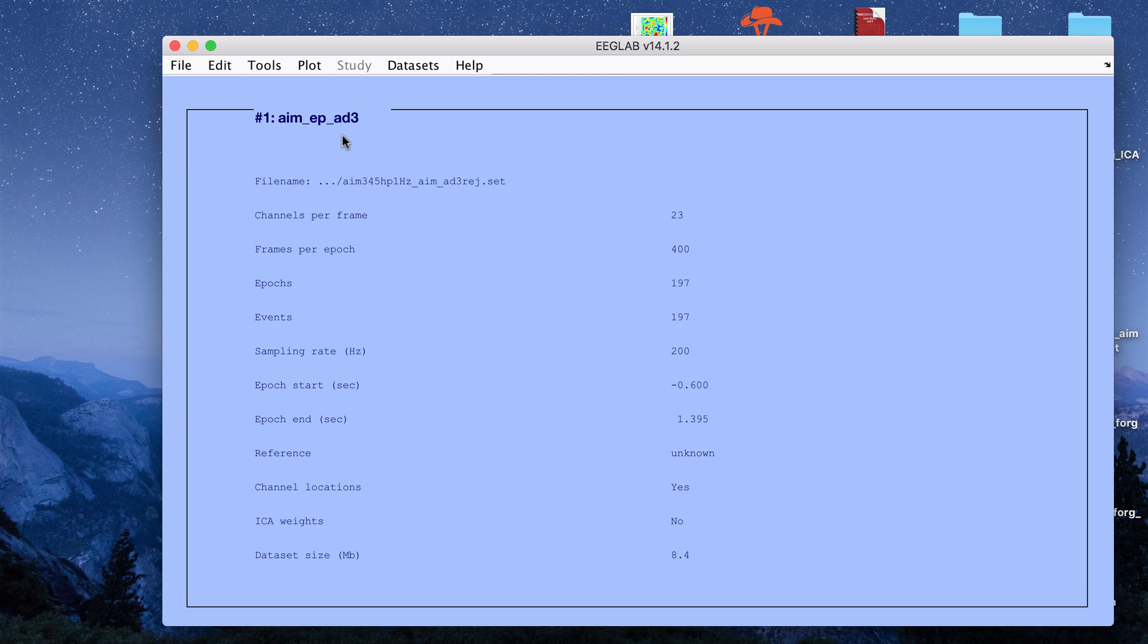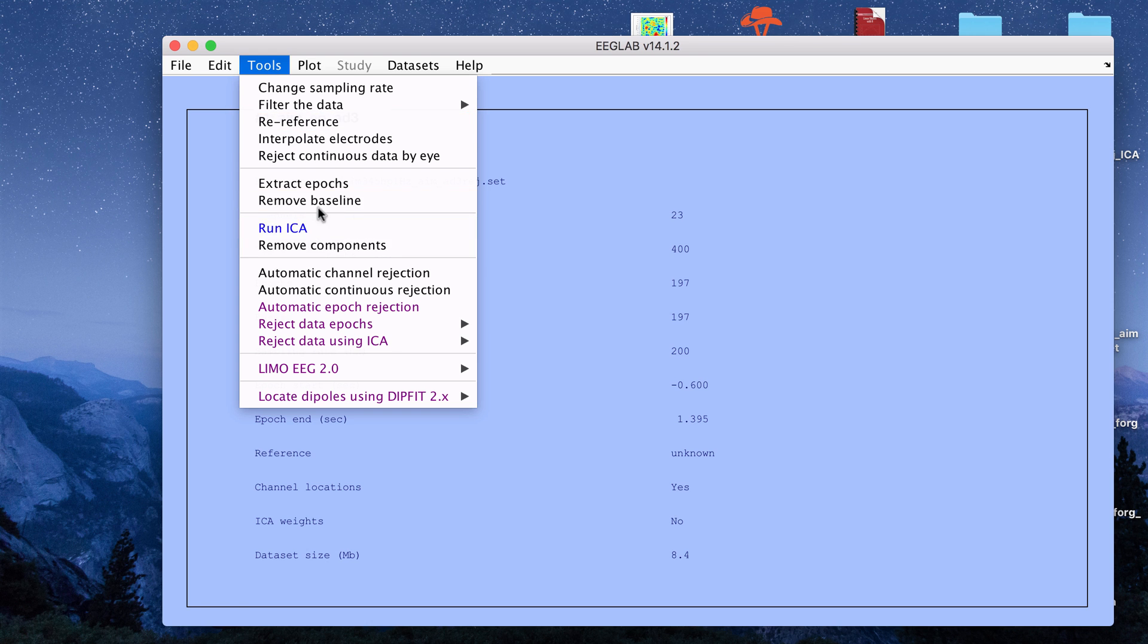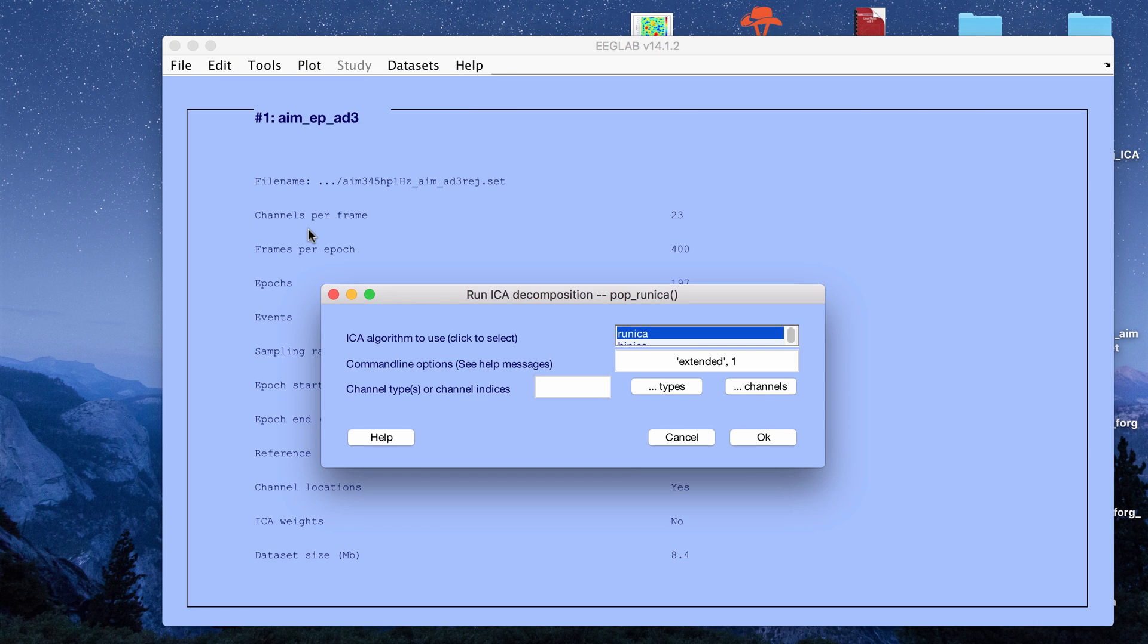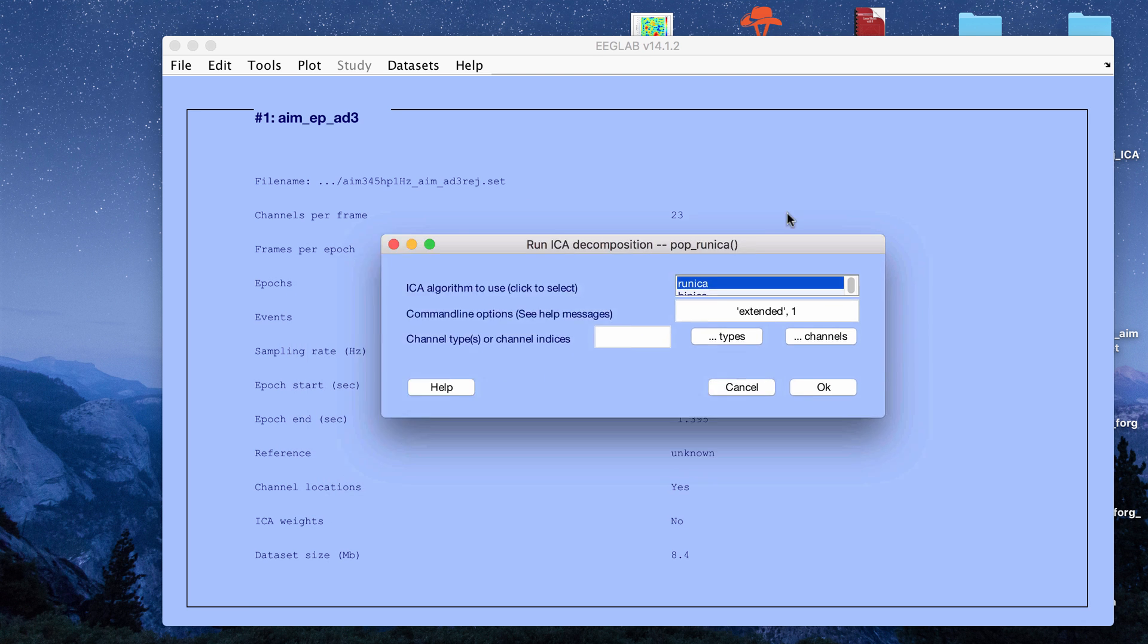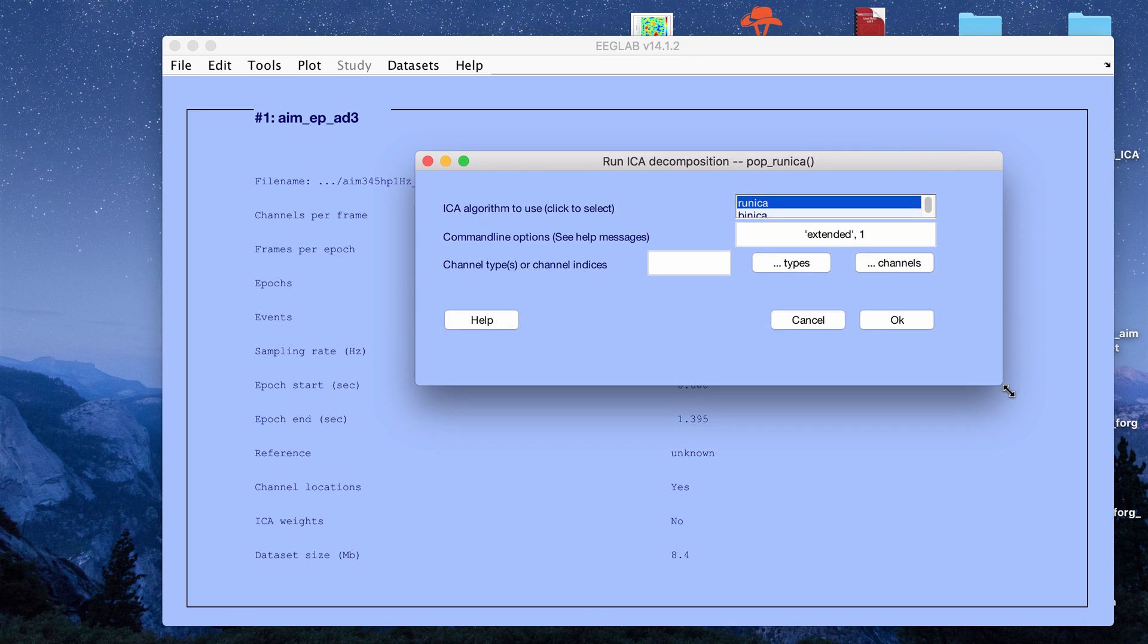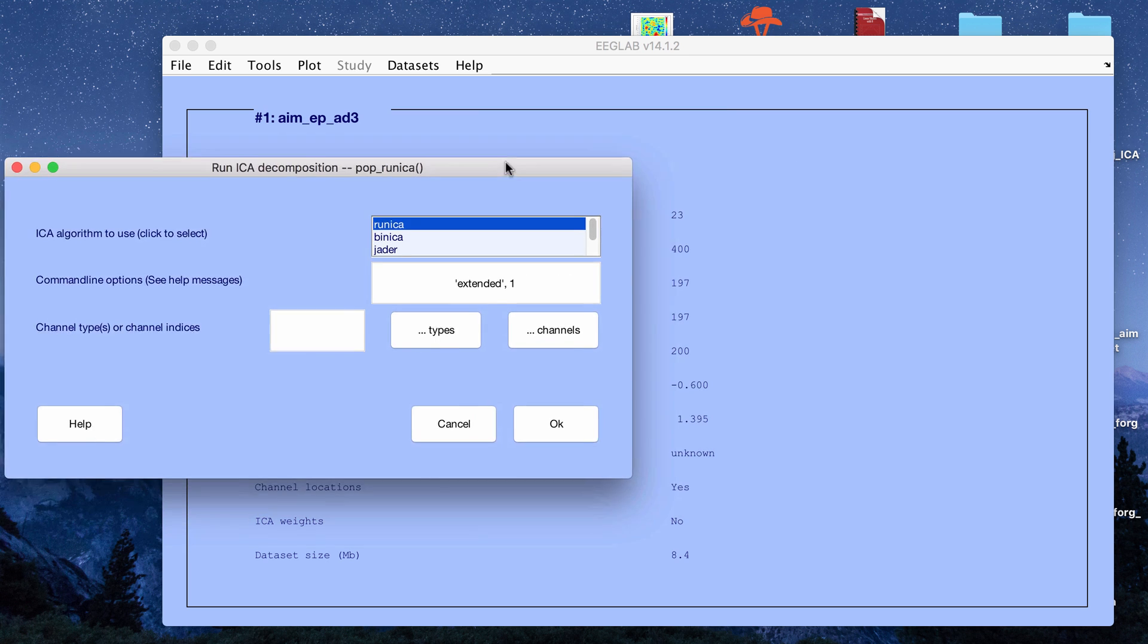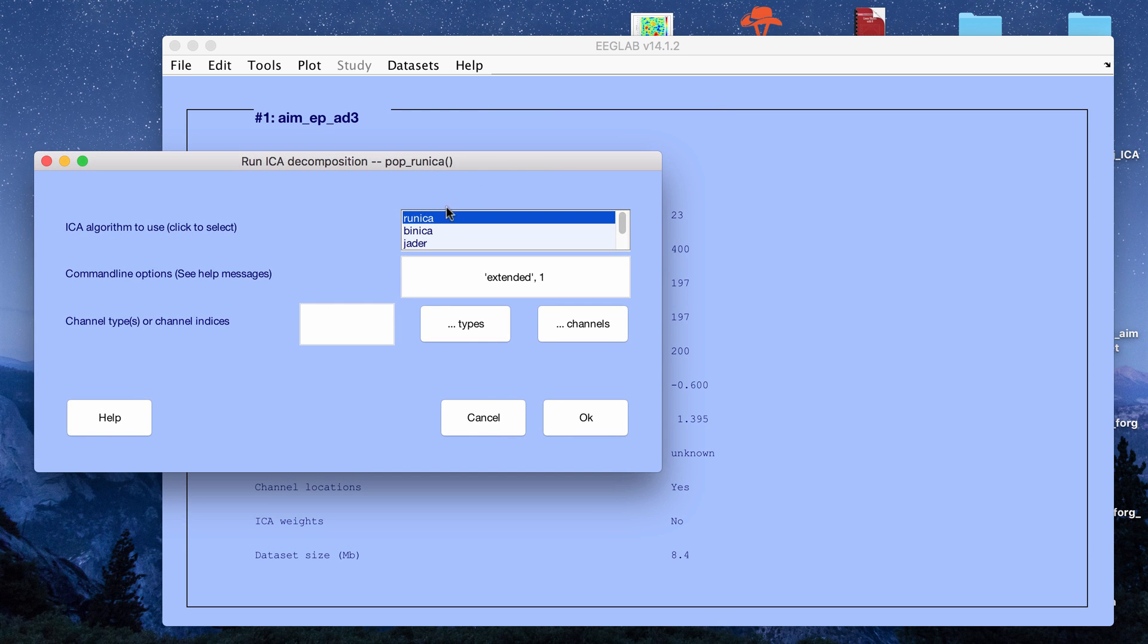To run ICA in EEGLAB, it's very simple. You go to tools and they go out of their way to put it in blue. You click run ICA. It will give you a couple different algorithm options to run ICA with.